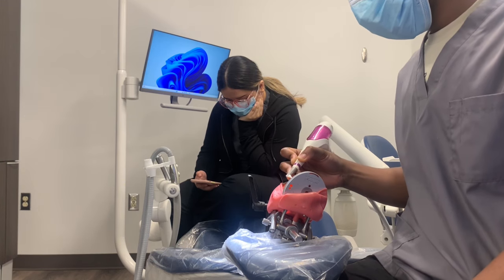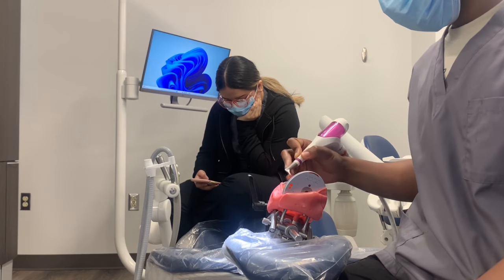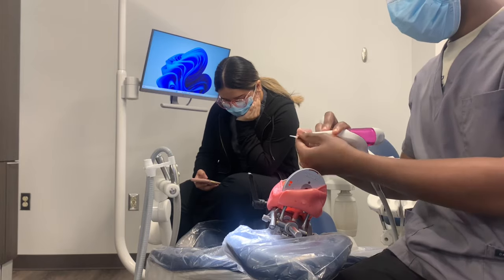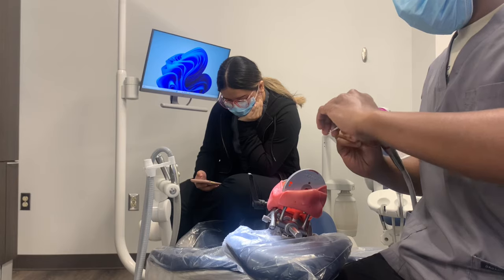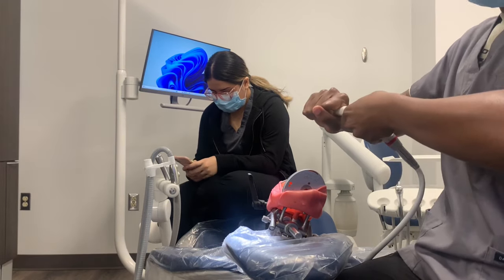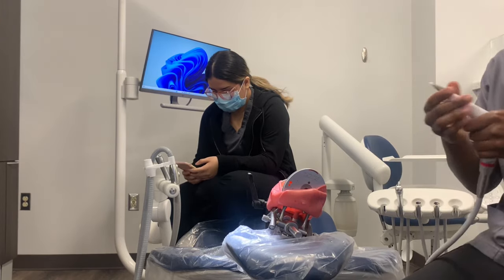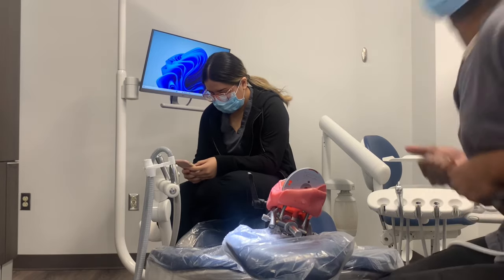There are actually two different tips you can use — one is for subgingival penetration and one is for supergingival. I started with the subgingival tip. You can see it has that plastic tip so you can insert it into the pockets, into the gingival sulcus. Here I am trying to switch over to the supergingival tip, and obviously I can't figure it out. It is too difficult — look how much I'm struggling!